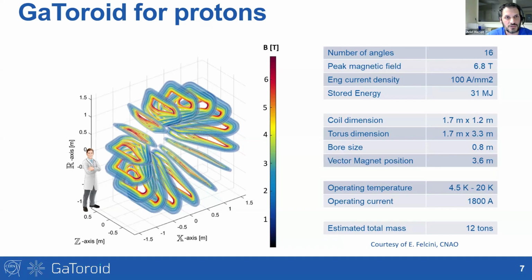So different energy can be used with the same system without changing the beam or moving any parts. And in order to do so, the magnetic field inside each of the magnet that you can see on this picture here is tuned.